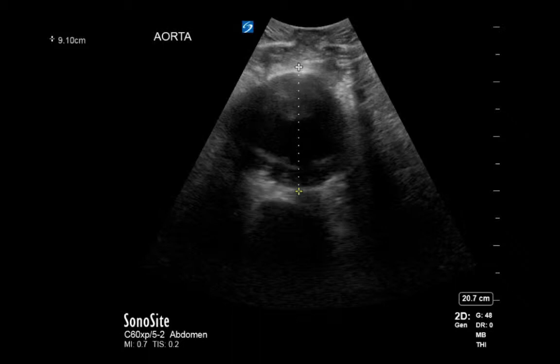I'm fortunate to work in an emergency department where we see a great variety of pathology, and we tend to see a ton of cardiovascular pathology. This manifests in the usual cardiac stuff, but we also see a ton of AAAs. For some reason, it seems like we're seeing more and more of these. Probably has to do with the population aging, etc. But we've spent a lot of time looking at these studies and picked up on some interesting tidbits. So again, we're going to work on looking at these and then trying to figure out some more advanced topics.